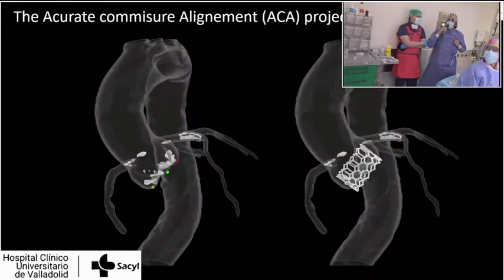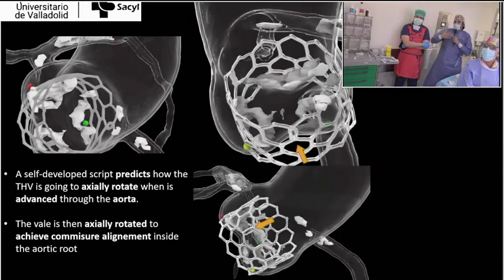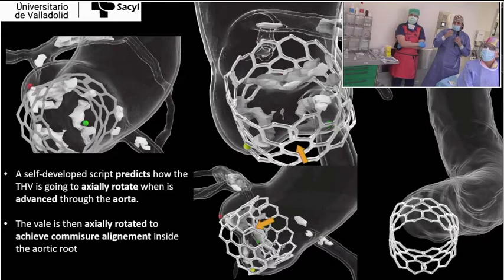Okay. Hello. Next slide. I would like to introduce this project we have been working on for some months now. Our aim is to be able to align the commissural posts of the valve with the native commissures. We developed a script that allows us to predict how the device is rotating when it's advancing through the aorta. Once in the aorta, we can then rotate it so that the commissural posts of the valve match the native commissures. You can see in the slides how we did that.